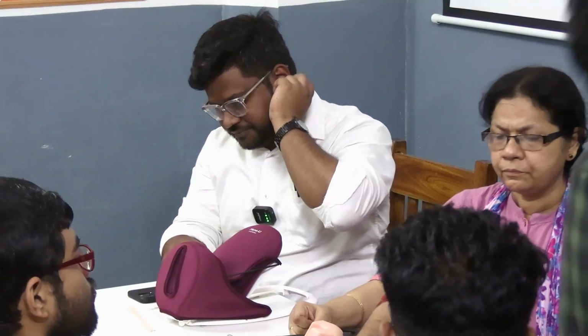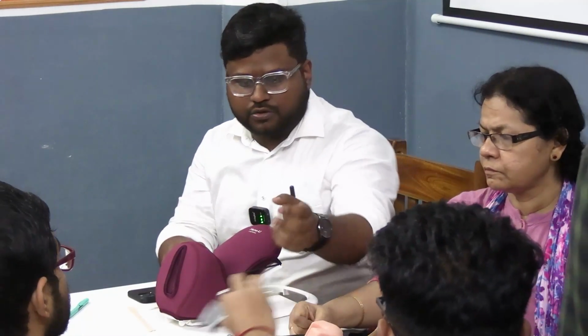We have had a class on the copper T. You got the Sims speculum, very good. Give me a Sims speculum. What other instrument do you need? Do you need to dilate after delivery for a postpartum IUCD? What did I say? You don't need a dilator. What do you need? You need something to hold the cervical lip.